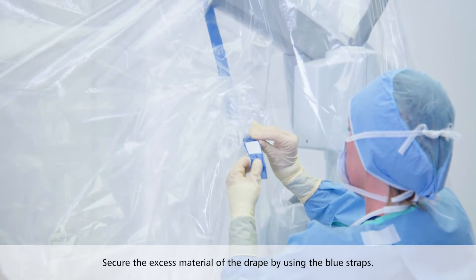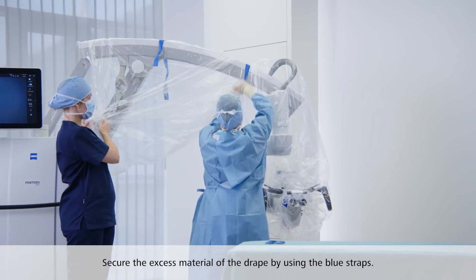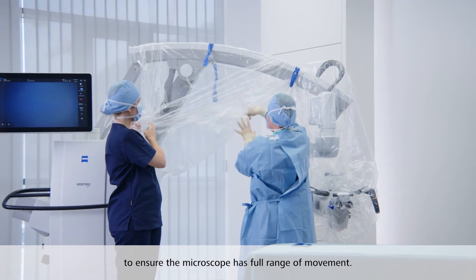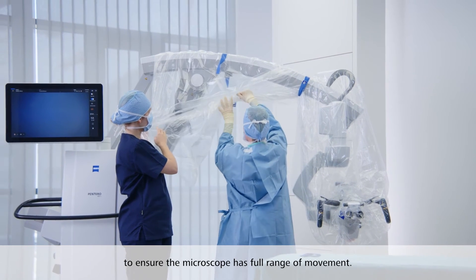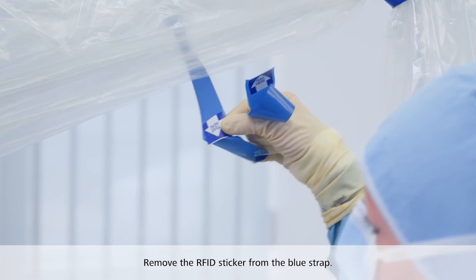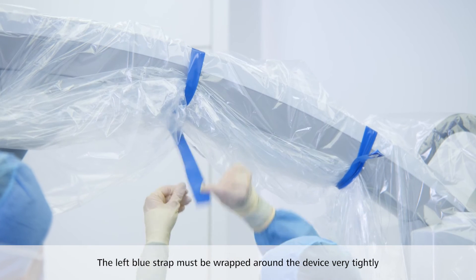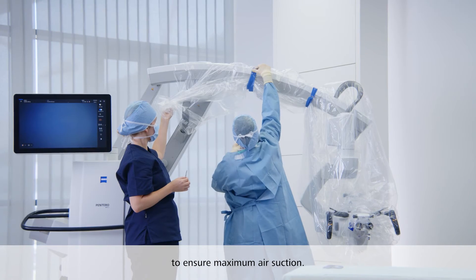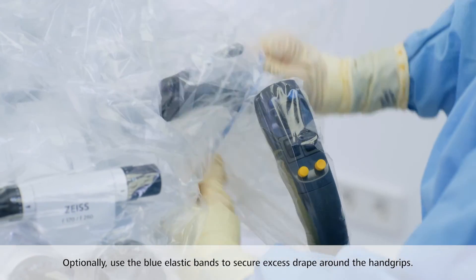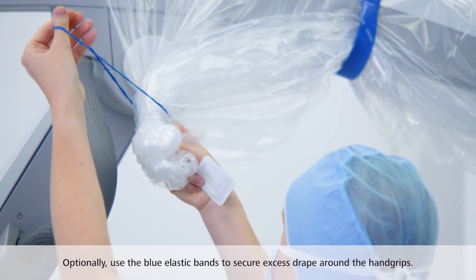Secure the excess material of the drape by using the blue straps. The right blue strap needs to be fixed with more slack to ensure the microscope has full range of movement. Remove the RFID sticker from the blue strap. The left blue strap must be wrapped around the device very tightly to ensure maximum air suction. Optionally, use the blue elastic bands to secure excess drape around the hand grips or other areas of the device.